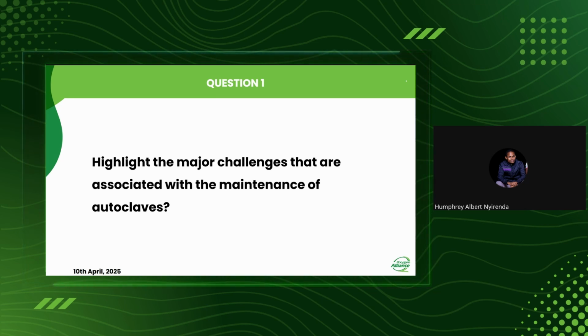So you can either use osmosis treatment or what we call deionized water treatment, where you use chemicals to remove the chlorine and the other ions, including the cations, from the water, so you can use it. Sometimes you can also use distilled water, but this is mainly used for tabletop autoclaves. But for the vertical autoclaves, which are front load, like the Shiva, TKR, you can use what we call deionizing treatment. Osmosis, I know, is a bit expensive, but it depends upon the funds that are there.